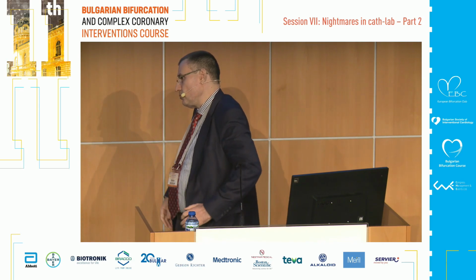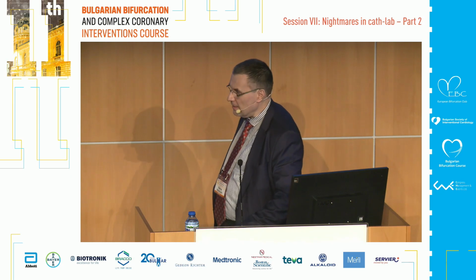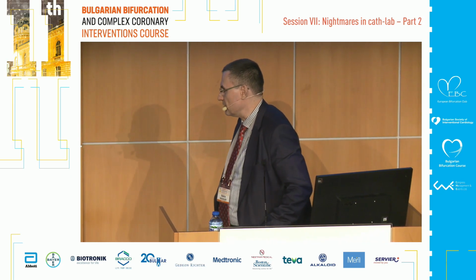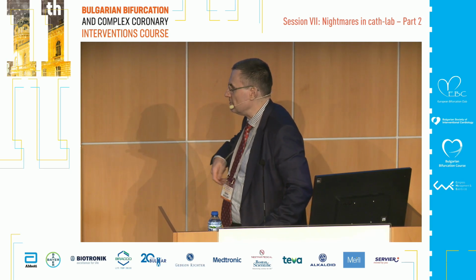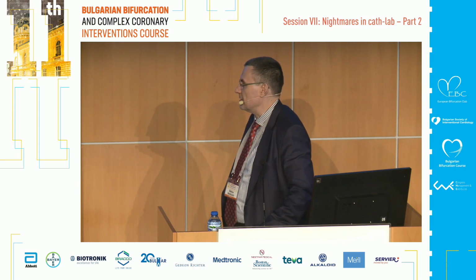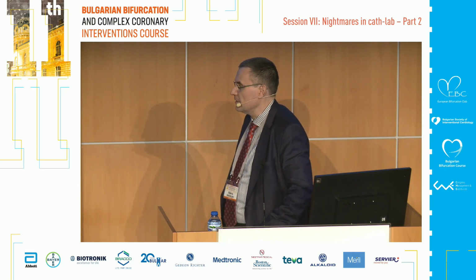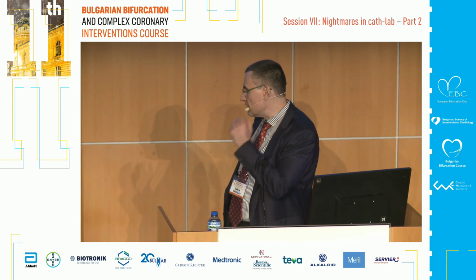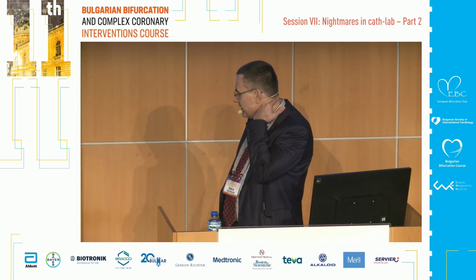The other 2 were at a time when we did not have a rota, because in 2022, in my current institution, we started the rotablation program. So the previous 2 were done the same way, just without rotablation.